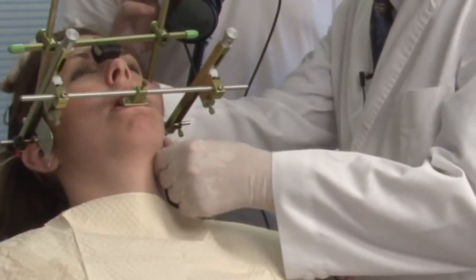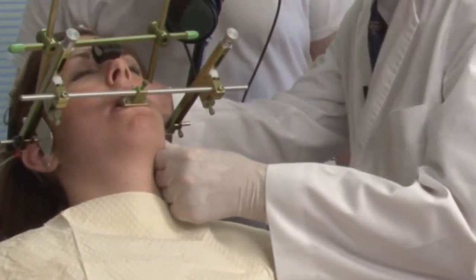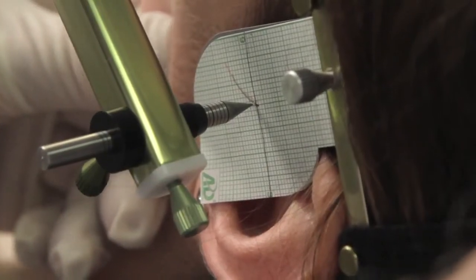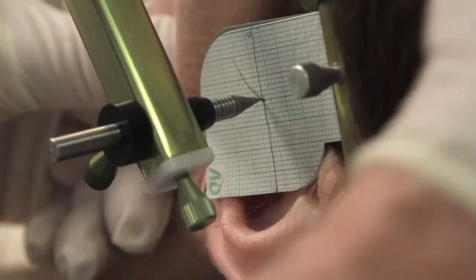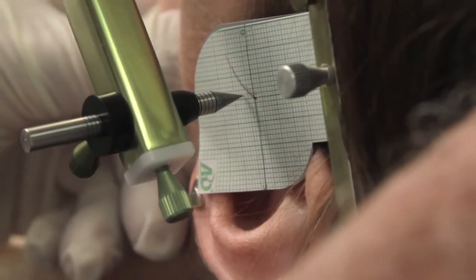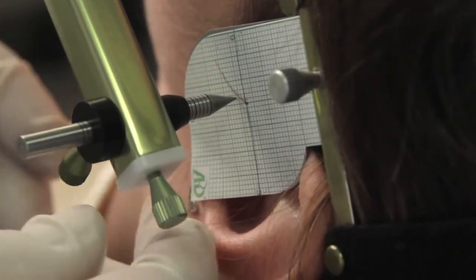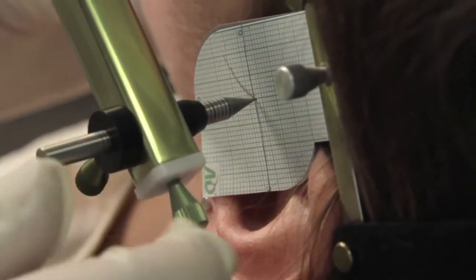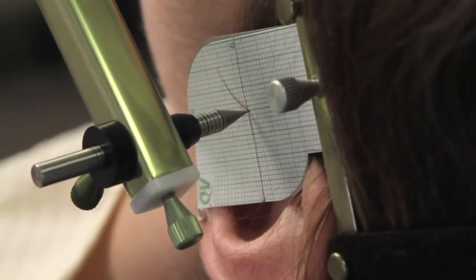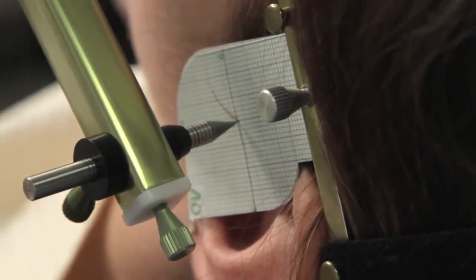And so I will then ask the patient to hold right there, stay in position, don't move. Make sure your stylus pen is touching the flag. Now move slowly to the left, right. Stop. Okay, that was way too much. We know that there's not that much side shift. She dropped the jaw out of the joint. If you now go back, if you watch the stylus pen movement, it dropped down and then moved so that she dropped the condyle. She's getting tired. It's been a long day, so I can understand why that happened.